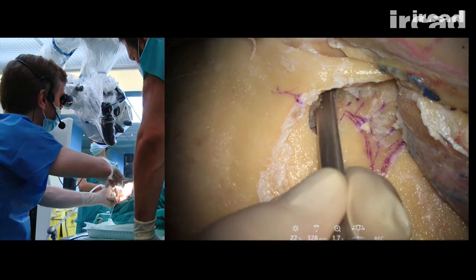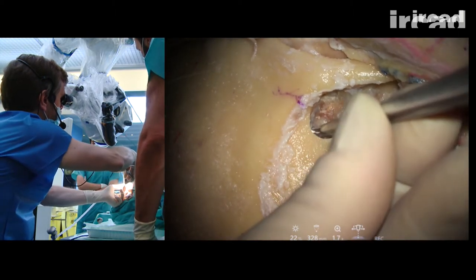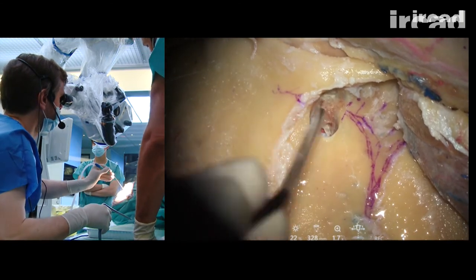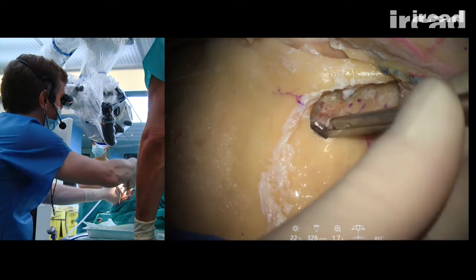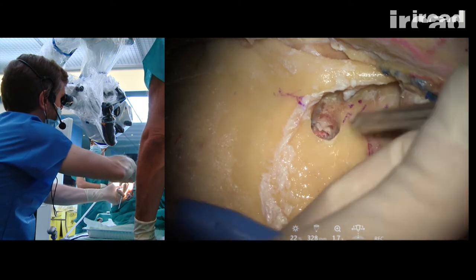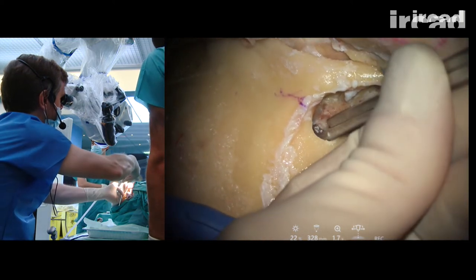And I can thin this bridge of bone, arroser un petit peu pour qu'on voie. Arroser bien. Alors, enlever la sciure d'os. Cannot find the dura here on this side.